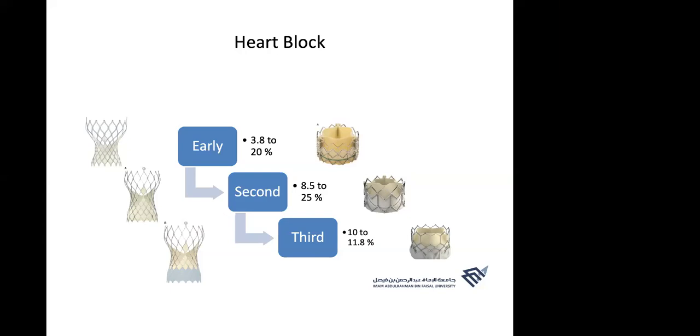No, the question they asked me: in some trials, it showed that even after 5 years there is still a significant difference in heart block between TAVI and the surgical group. It's increasing, so it's not related to the initial procedure. Why do these patients after 5 years have more heart block than the surgical group? Yeah, this is the reason.